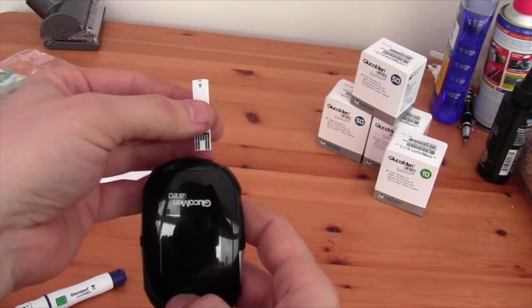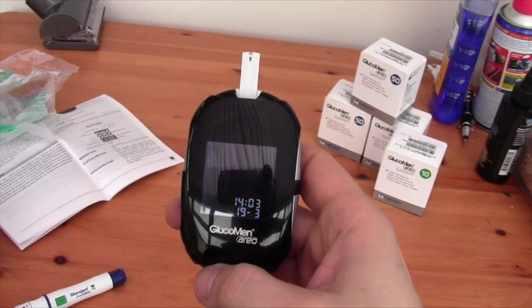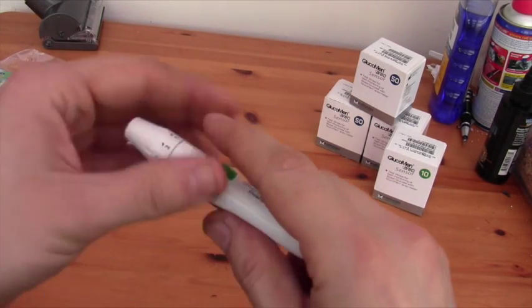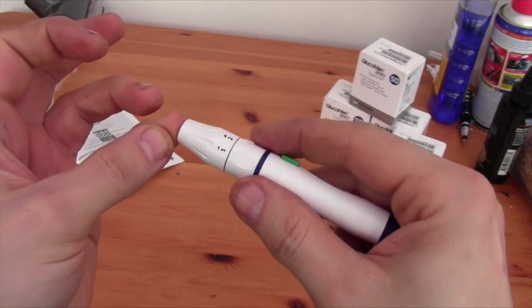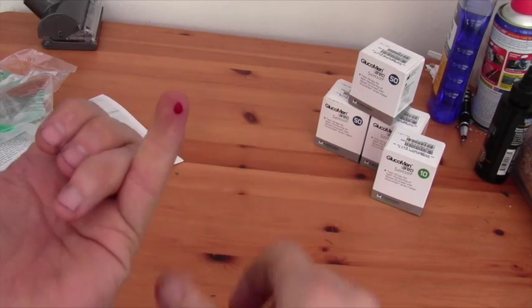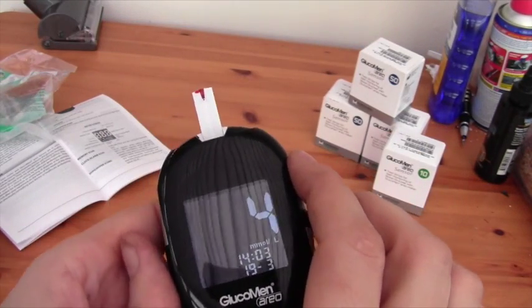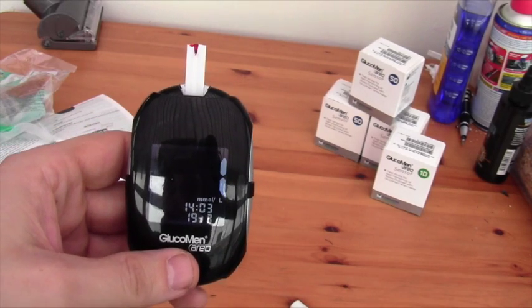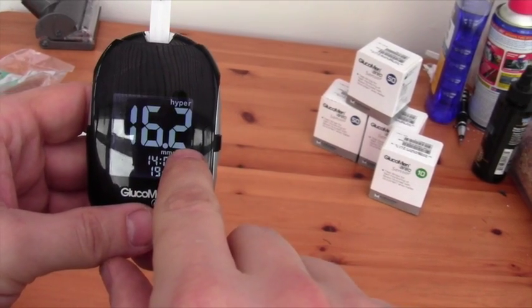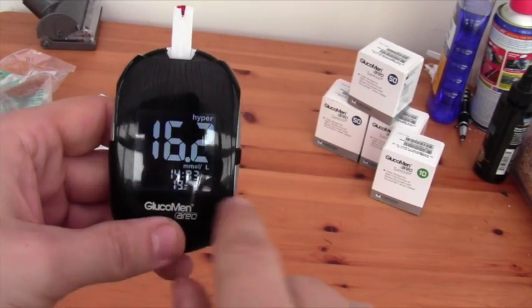Let's move on to taking a test. Literally it is as simple as pushing the strip in the top. A little blood drop symbol will appear asking you to get the blood. We take the lancet device and extract enough from my little finger. Let's take that blood up. Unlike the Bayer and some other meters, you do have to make sure you get enough blood on — you don't get a second chance at it. I've got a reading of 16.2 here, so I've been a very naughty boy. That's the little hyper alert. That stores it in your meter.